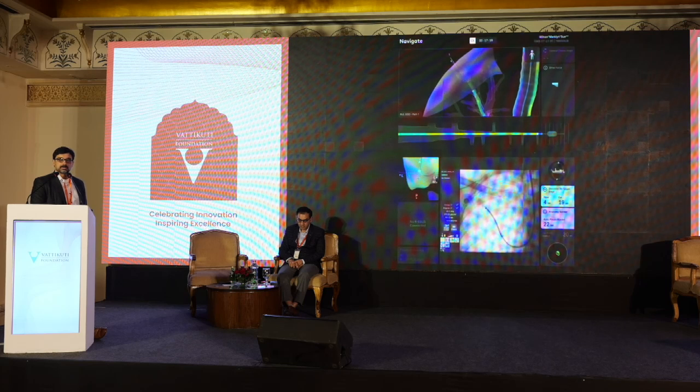Once that's done, we place a fiducial marker. This fiducial marker is a Cook coil, and it's infused with ICG on the back table. It's infused with either 0.5 or 1 milligram of ICG at the beginning of the procedure, and we let it sit and soak. And then again, right before we deploy it, we infuse more ICG.